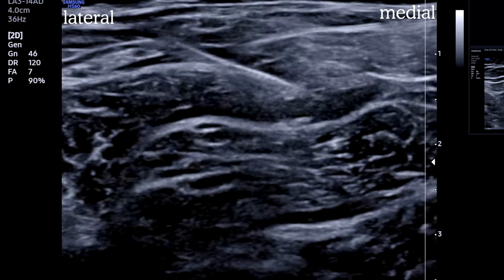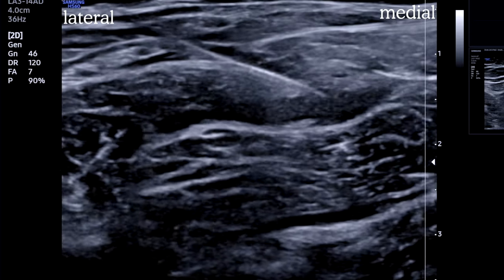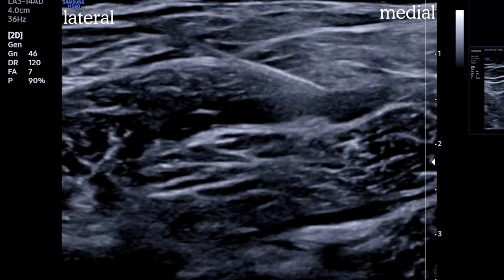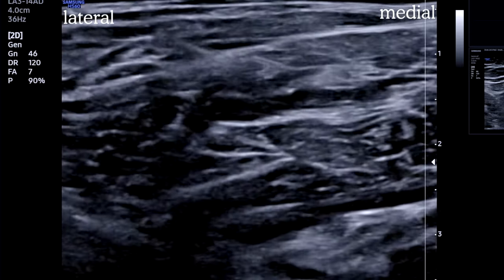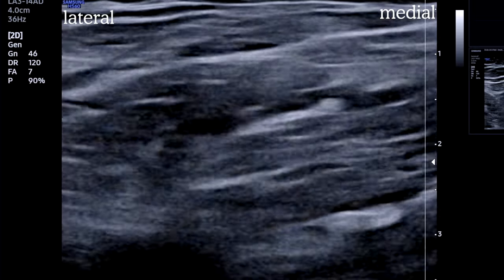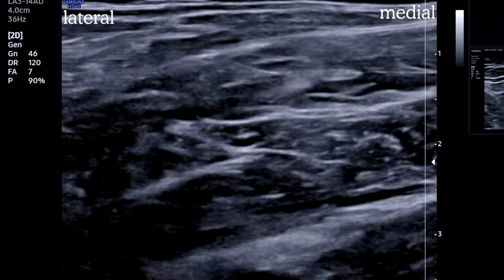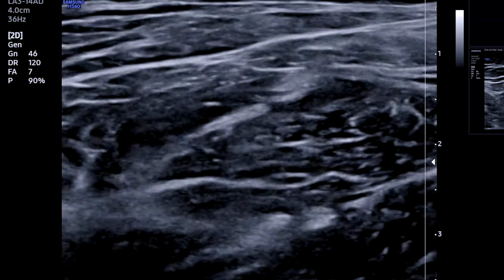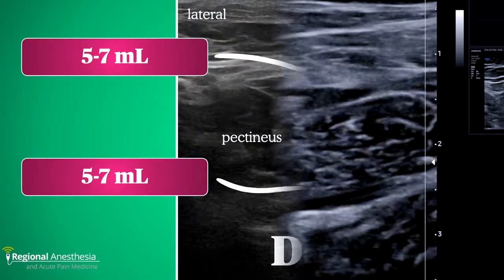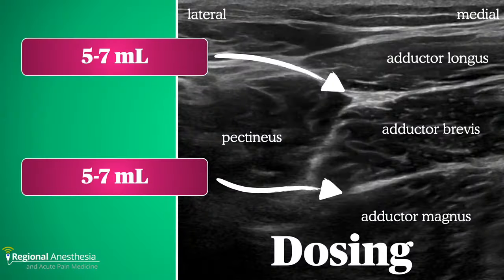That's also opening up nicely. Finally, we scan back and forth a little at the end to confirm we're happy with the spread. The dose we'll use is between five and seven mils — it doesn't take much to block these small nerves.